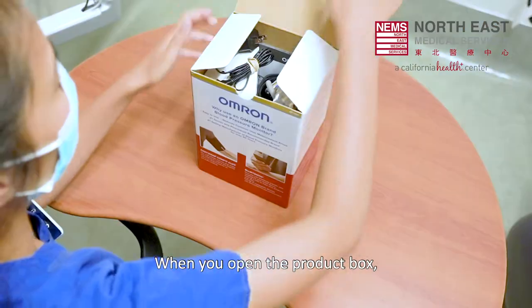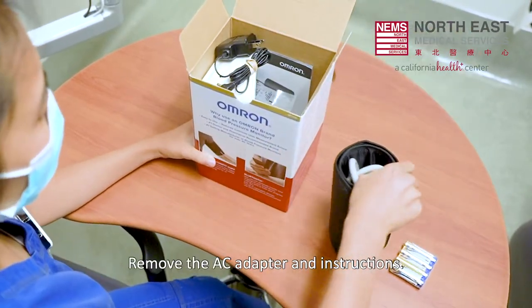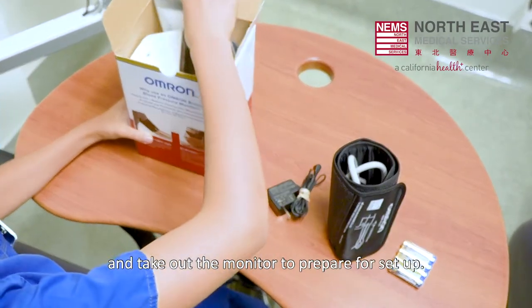When you open the product box, take out the arm cuff and the set of batteries inside. Remove the AC adapter and instructions, and take out the monitor to prepare for setup.